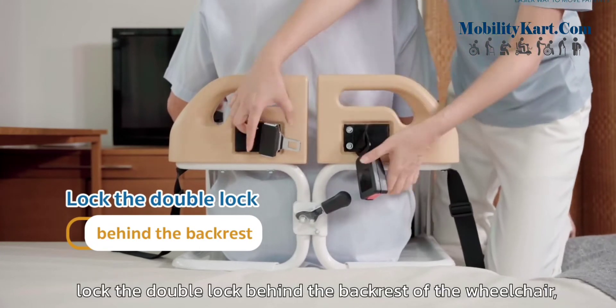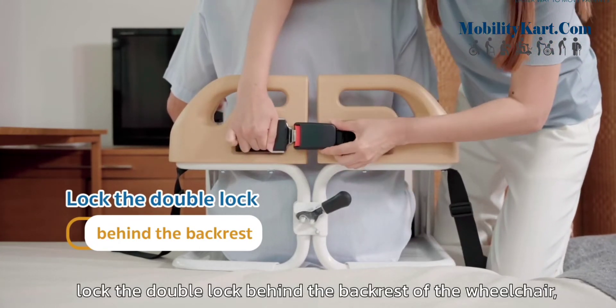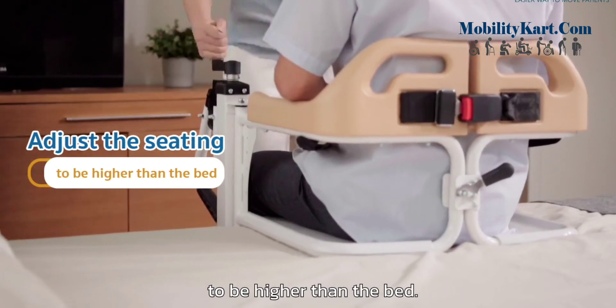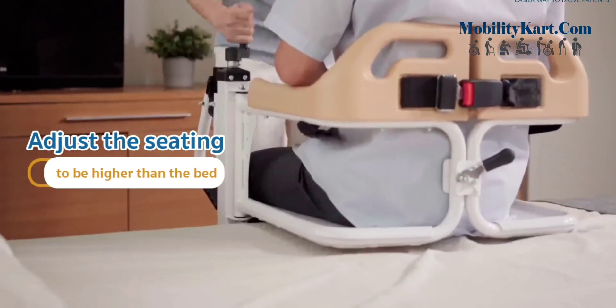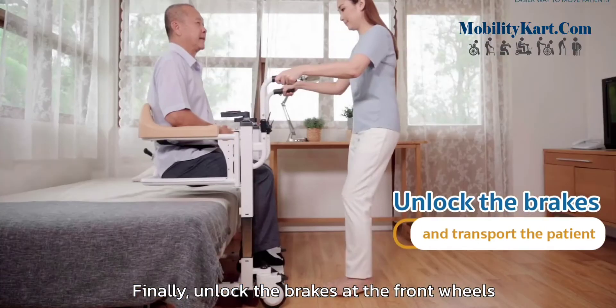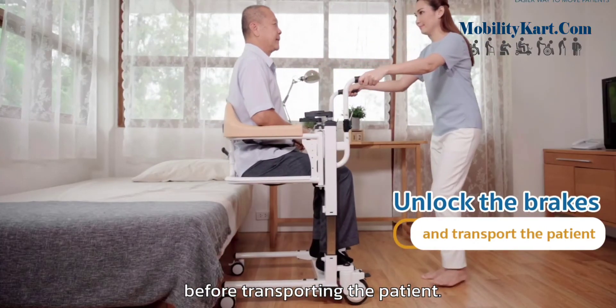After that, lock the double lock behind the backrest of the wheelchair and adjust the height of the seating to be higher than the bed. Finally, unlock the brakes at the front wheels before transporting the patient.